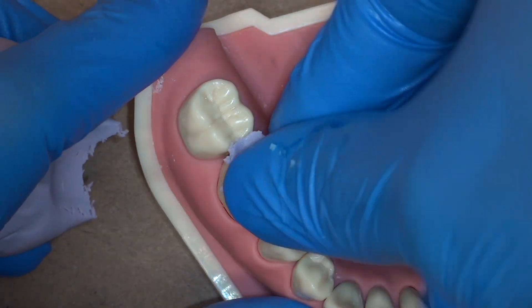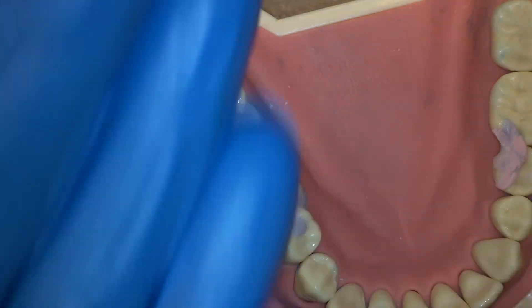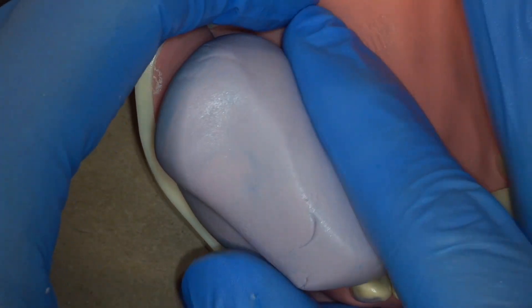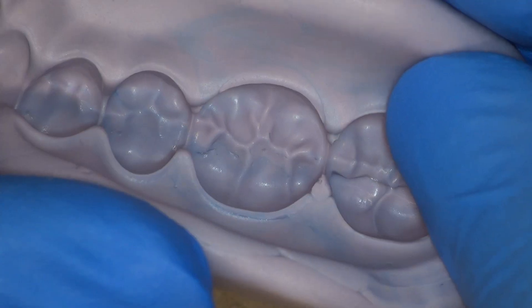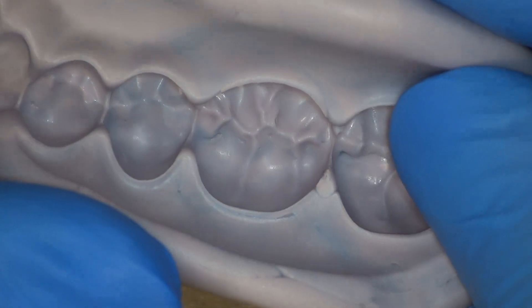Hi, I'm Dr. Mora. Today we're going to be fabricating a temporary for the number 30 crown prep done in the last video. The most important step is to put a little bit of the putty on the occlusal surface before making your temporary putty. We want to see sharp, defined occlusal anatomy as seen here.